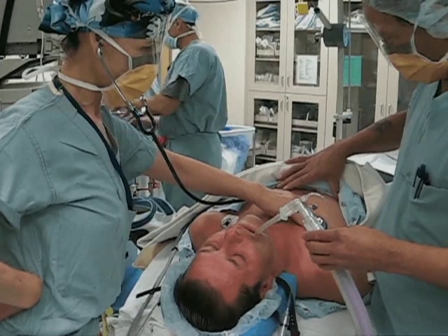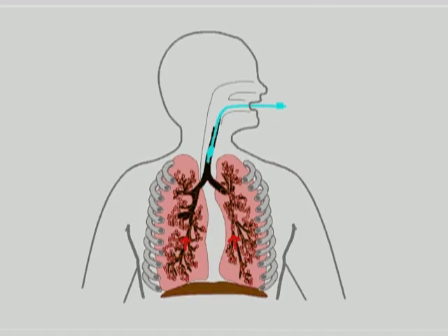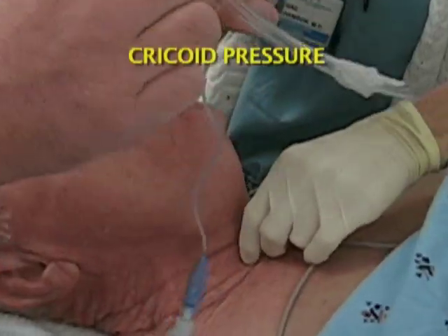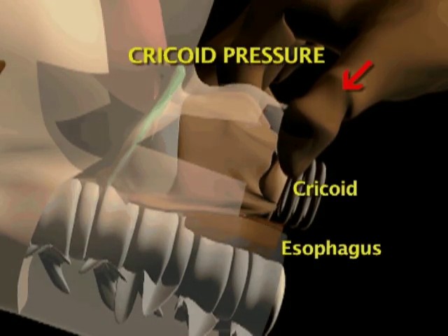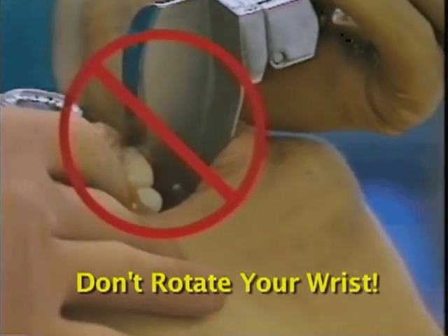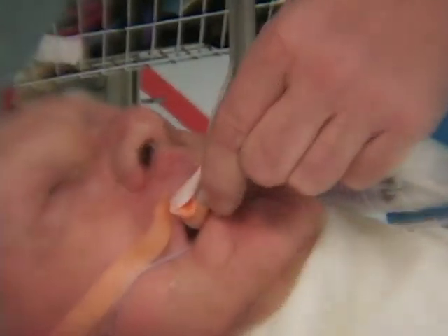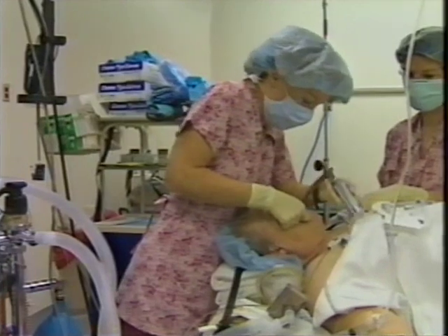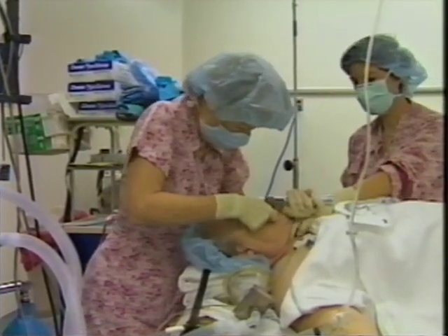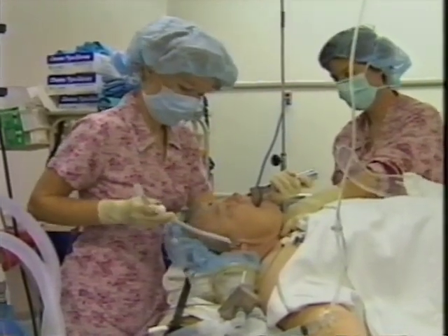knowing how to verify tube placement and correct misplacement, using tactics to improve your visualization of the larynx when it's less than optimal, learning to avoid common errors, and knowing when and how to extubate. Complications can occur even with perfect medical management, and you must know how to recognize and to treat them. However, preparation, gentle technique, and attention to total patient well-being minimizes the risk.